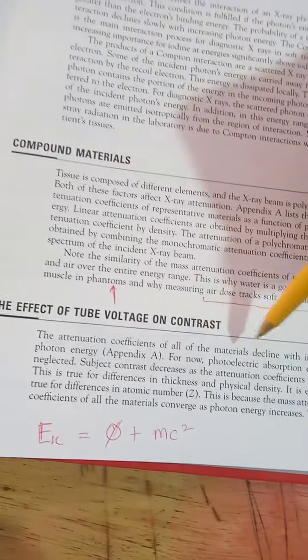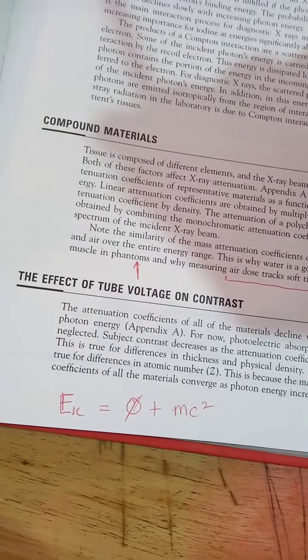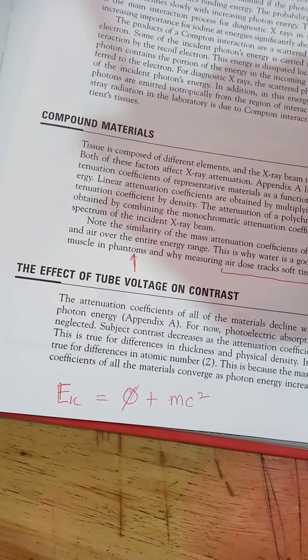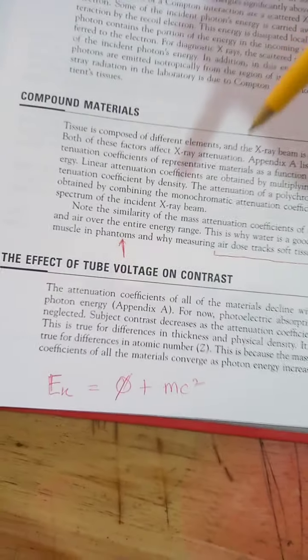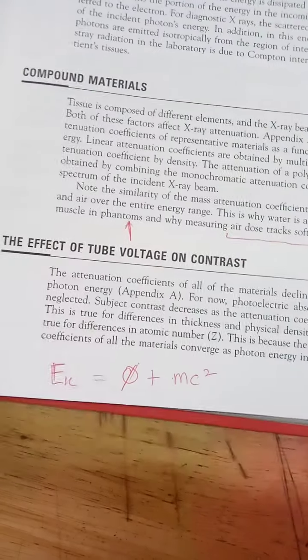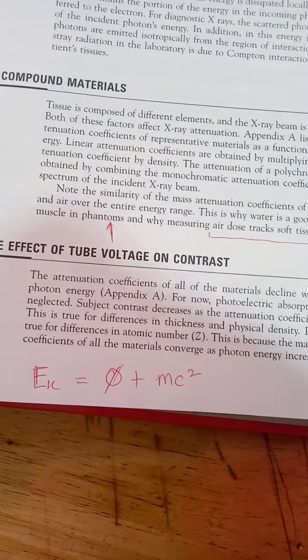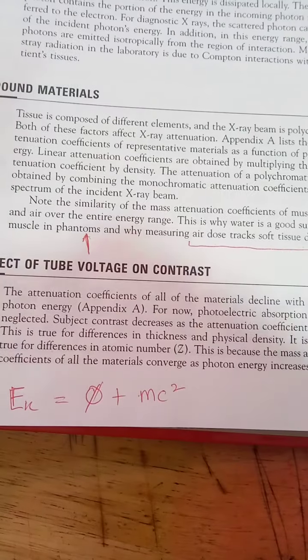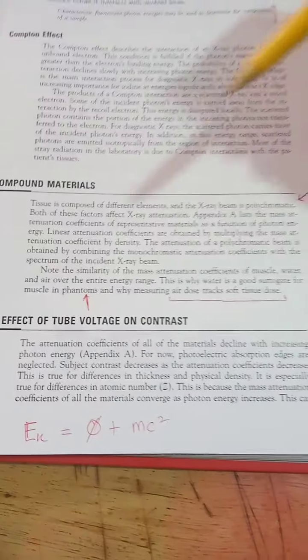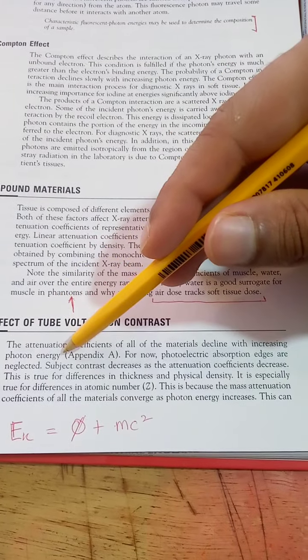The attenuation coefficients of all materials decline with increasing photon energy.